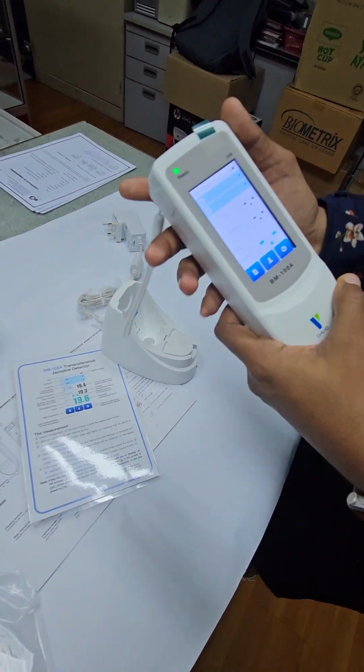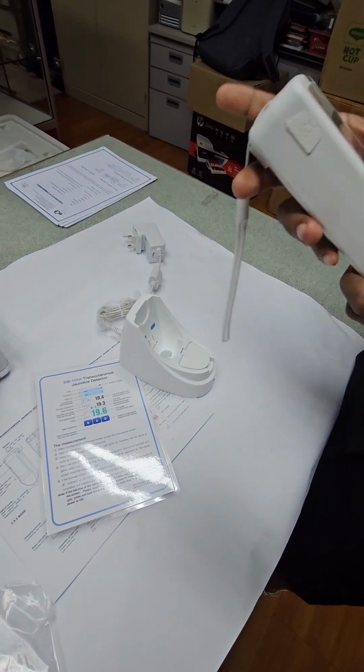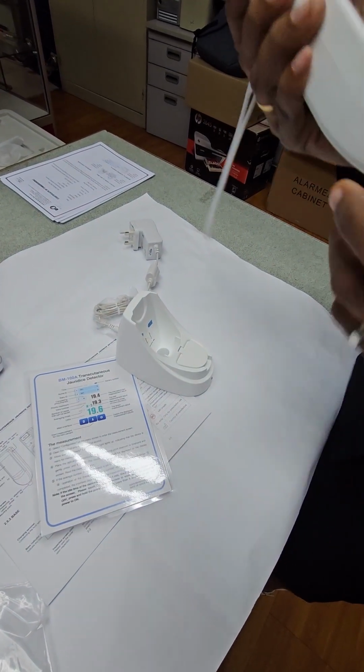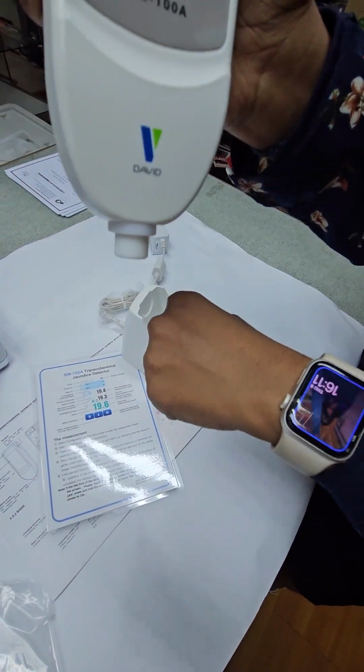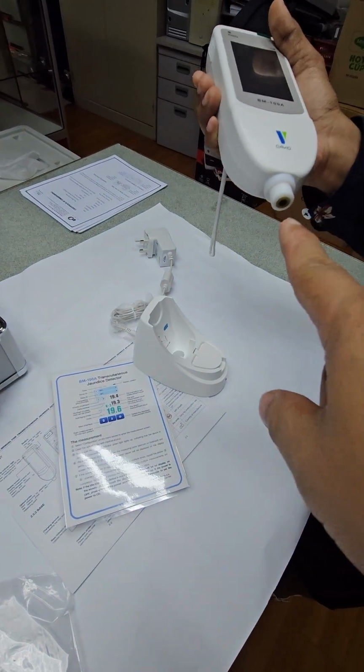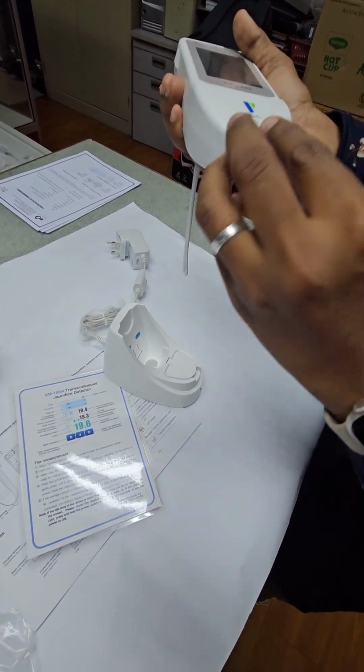So every time, the maintenance is basically cleaning the probe with an alcohol swab. Alcohol swab here only, this part, because this is the part that contacts with the patient, different patients. They shouldn't touch inside. Yeah, the surrounding only, the whole part.